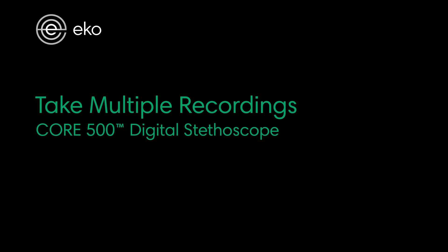Hey there! We're going to show you how to take multiple recordings at a time with the Core 500 and keep your phone in your pocket. Let's get started.